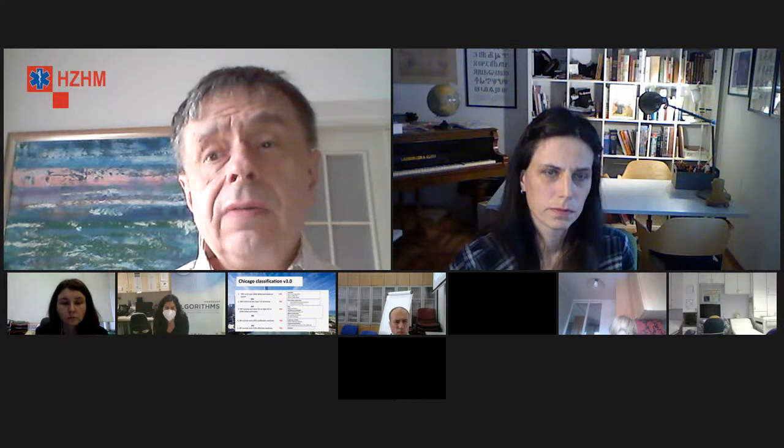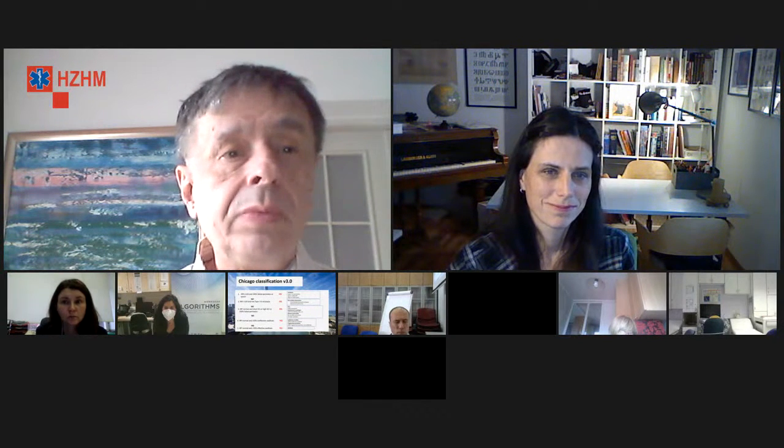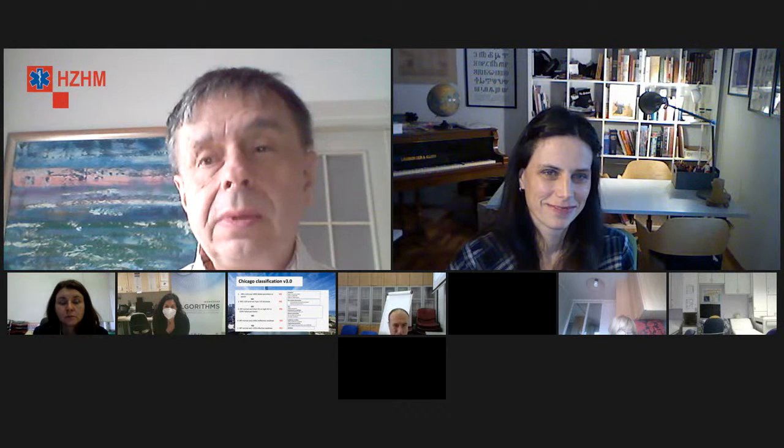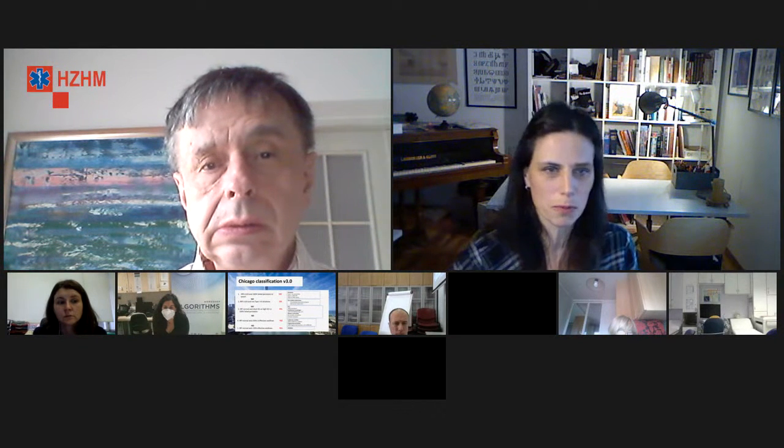Dakle, najlakše je stisnuti enter, dobiti Chicago klasifikaciju, uzeti ono što je jasno, ali vrlo često to traje puno duže, čak i nego što nam HZZO prizna u minute našega rada, koliko ta pretraga vrijedi, kako se ja zafrkavam. Dakle, nekad treba stvarno se potruditi oko svega toga. Da, mislim da taj humani faktor je zapravo vrlo bitan, da ne smijemo samo robotu prepustiti da izračuna i definira pacijenta.